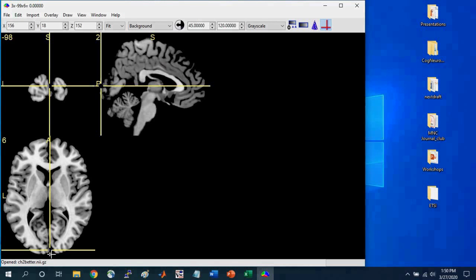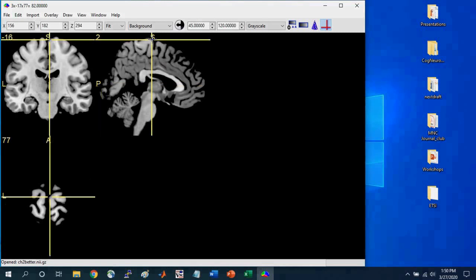So one thing you can do just to help get a sense for navigating the brain, you can select all the way to the top by the S. So the S is, again, the superior. It's also called the dorsal portion of the brain.